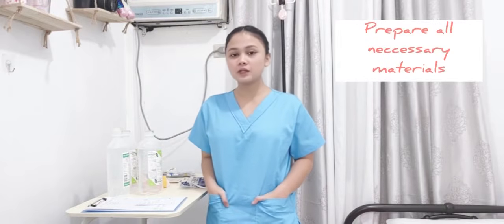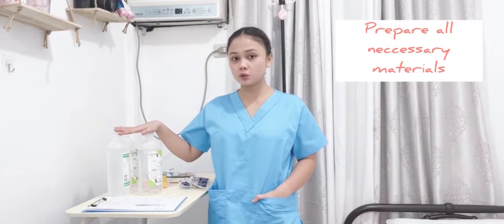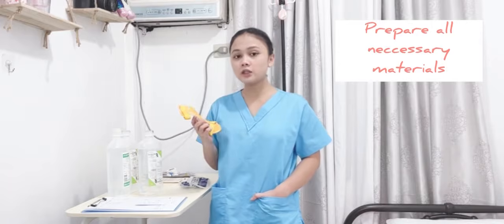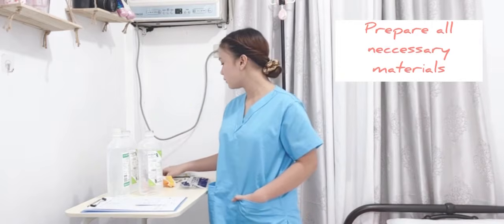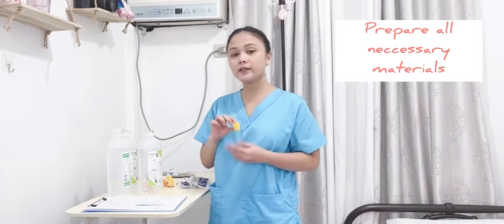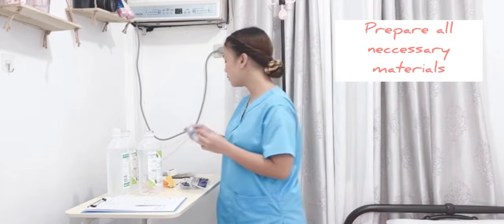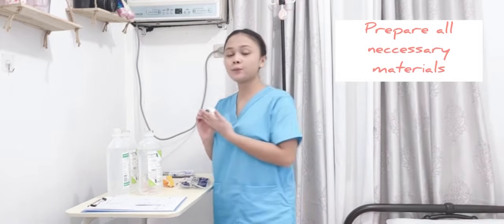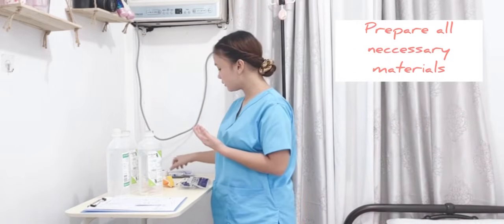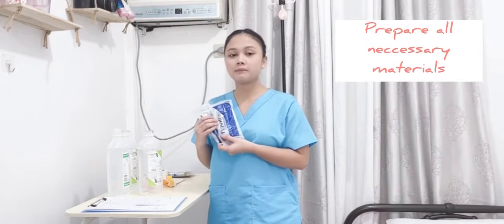Now, before we proceed to the procedures, we will be preparing all the materials needed. We have here the correct IV solutions, the adult splint, a sterile glove, the tourniquet, the trifuse, micropore plaster, an IV cannula, and lastly the micro and macro drip set.